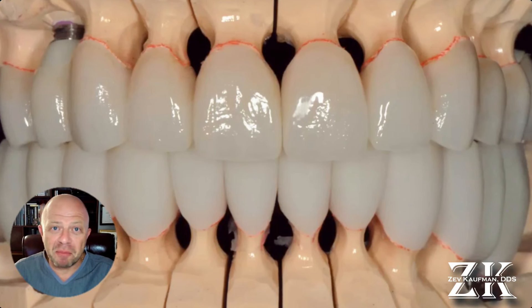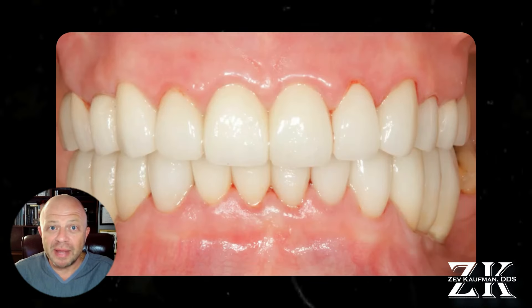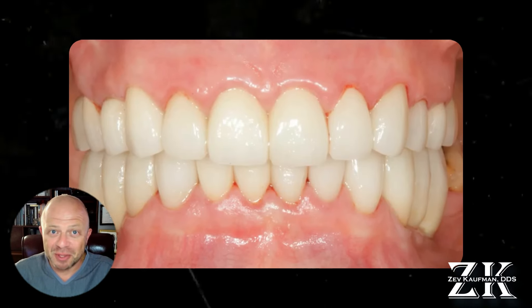Here we go again with our common theme. My technician produces a beautiful set of provisionals for the top and the bottom jaw. We prepare the upper teeth, take off the old crowns, cut everything down, trim the gum to the height that we want, take out a couple of teeth, and place a couple of implants — all in one day.